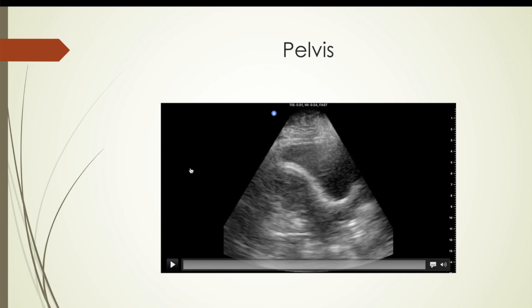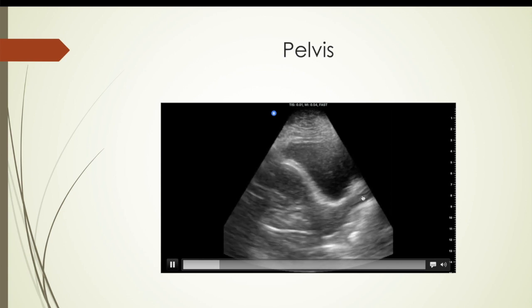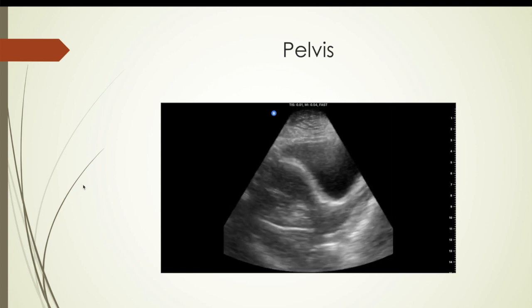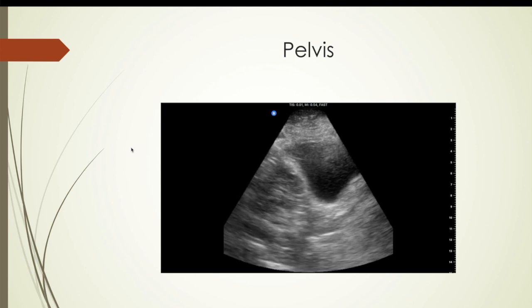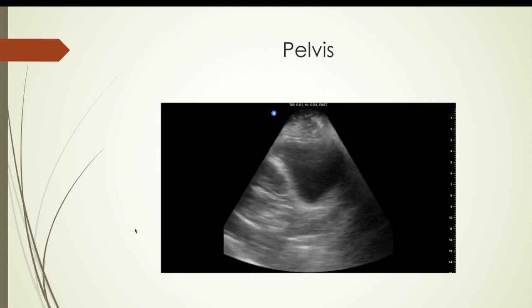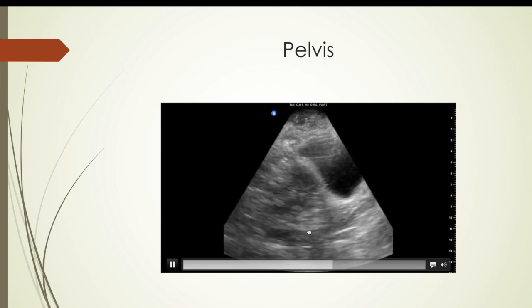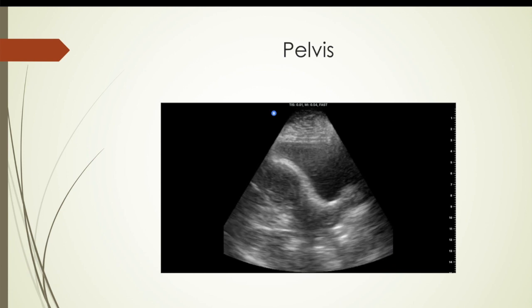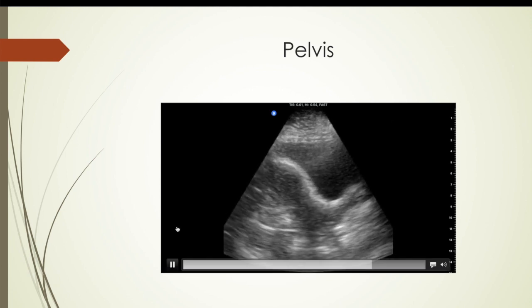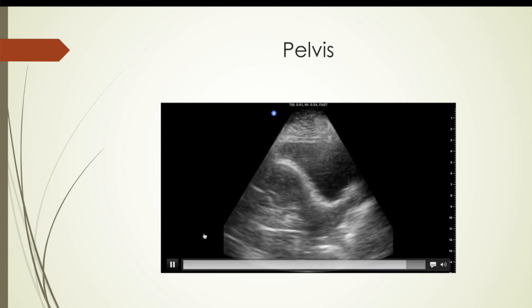Here is a pelvis — uterus. We can thank my wife for this; she was a good sport and let me scan her. You can see the bladder here, this is uterus, this is cervix, this is vagina. This was with the FAST setting as well; I tried the abdominal setting and it cleared up better. But not bad for the first time. Normally you'd need a curved linear probe on a regular ultrasound for this — the single probe does it all with a button.